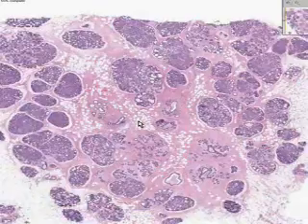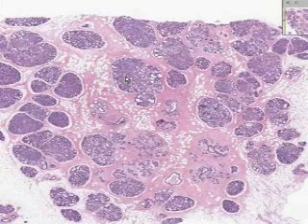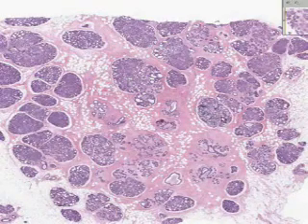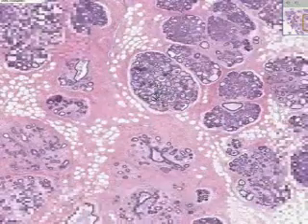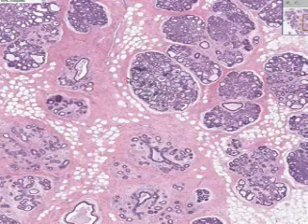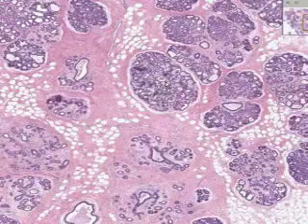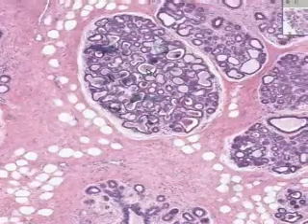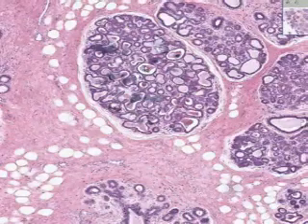This could be perhaps a pregnant woman or an early lactating woman, but usually in lactation these little acini are much, much bigger, so I suspect this is only a pregnancy. And in the active breast lobules, you can see that the acini are filled with proteinaceous material. This is called milk, and if you took a drop of milk and stained it with hematoxylin and eosin, the proteins in it might look very much like this.